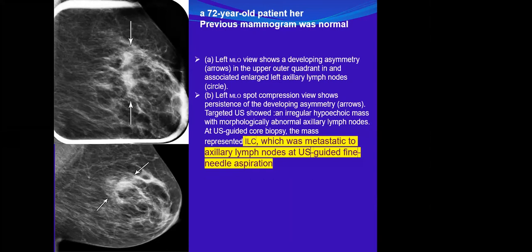The reason is what? As I ask you, yes, it is real, but why does carcinoma not disappear, or maintain its size and shape on spot magnification? Why doesn't it show significant change?